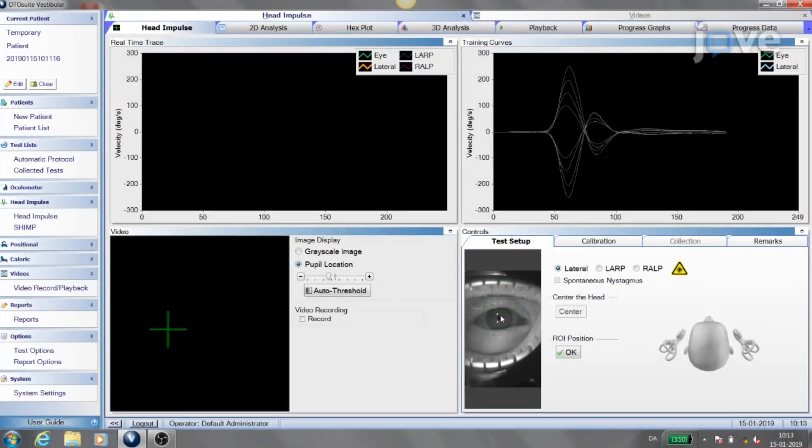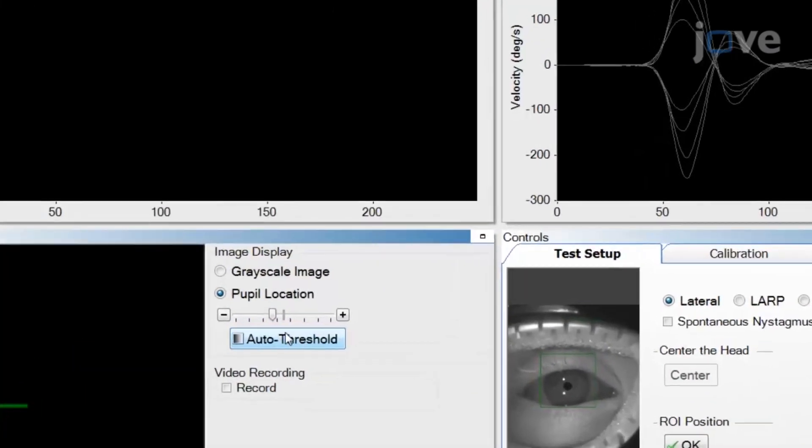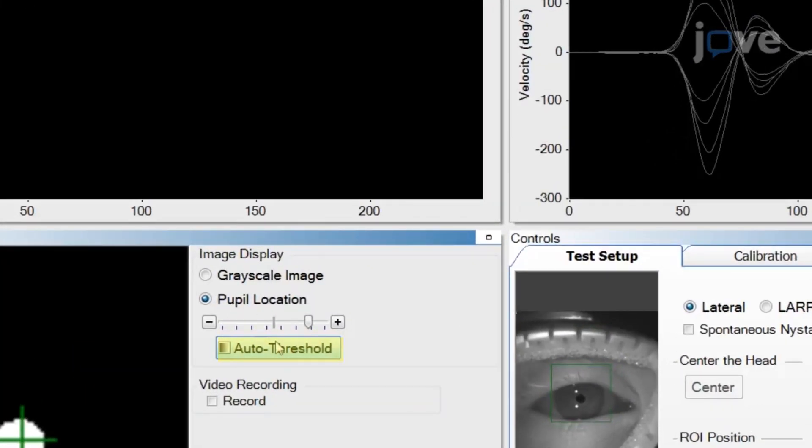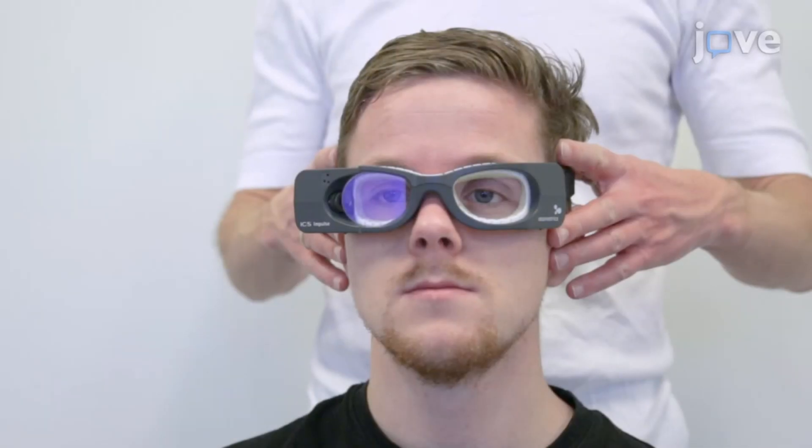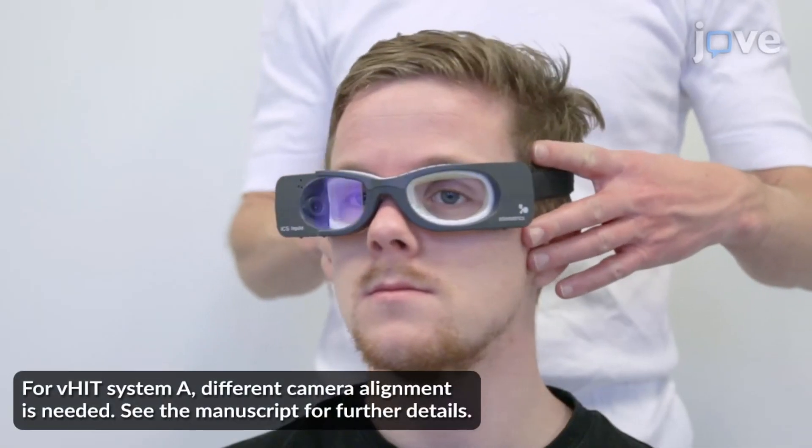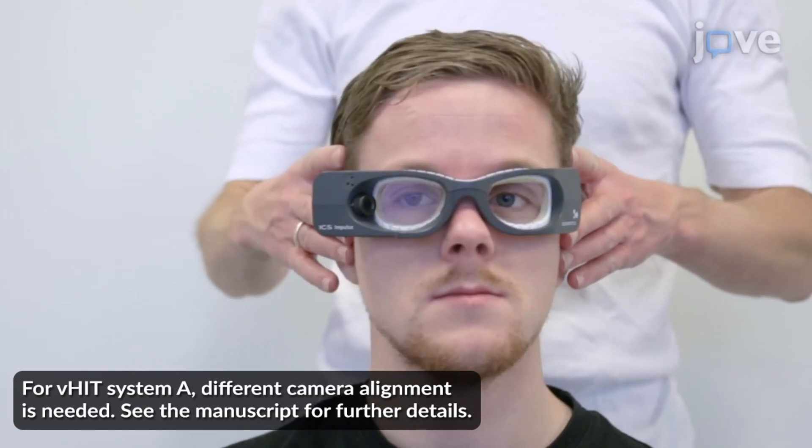For VHIT system B, position the region of interest around the pupil and select Auto Threshold on the laptop. Finally, assess the tracking of the pupil by having the participant make short horizontal head movements prior to initiation of the test.